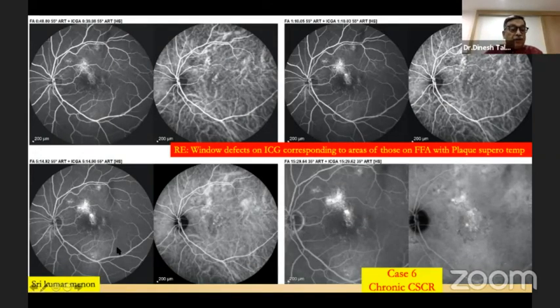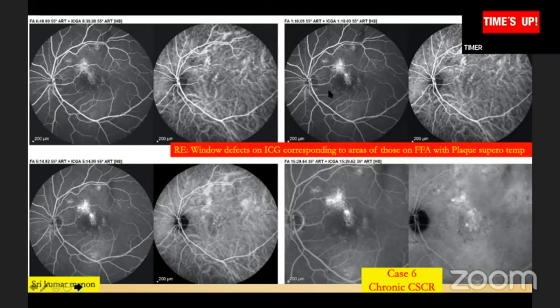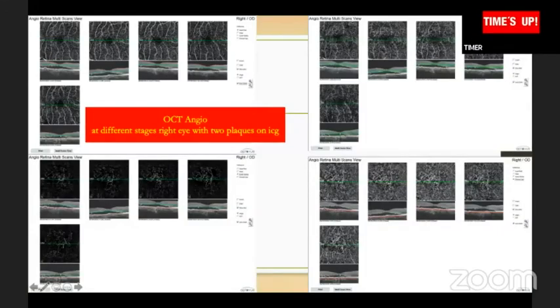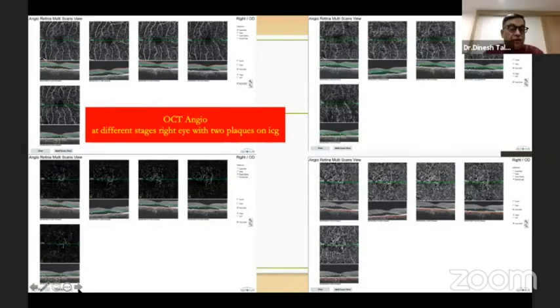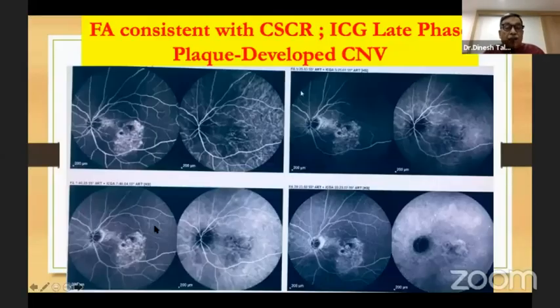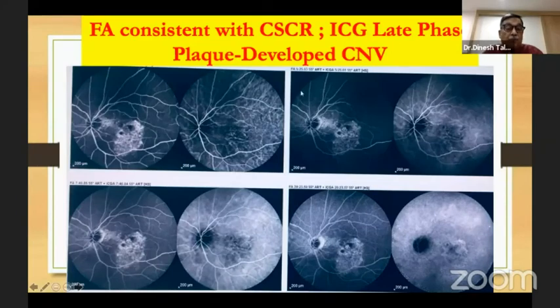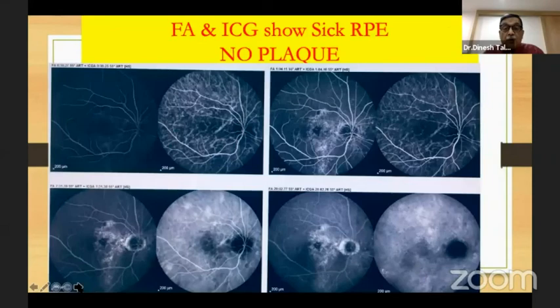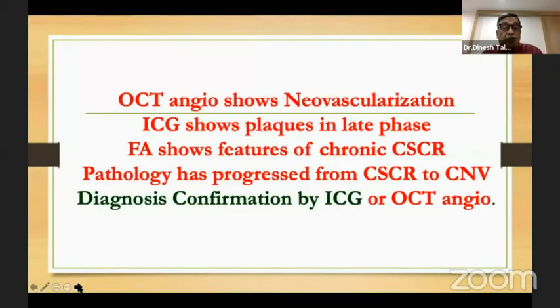This is another patient showing those ICG window defects in CSR. Importantly, sometimes the ICG may show that a plaque — a CNVM — has developed within a CSR case, and you can identify that on ICG.